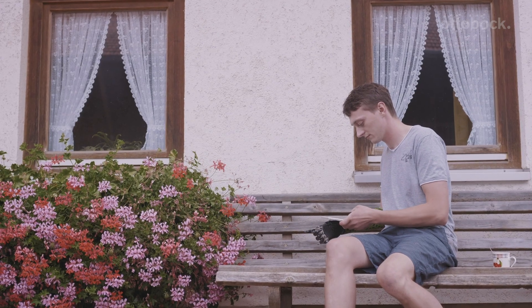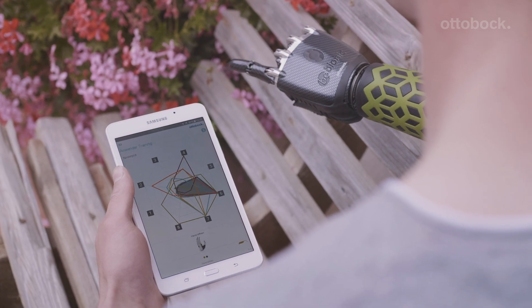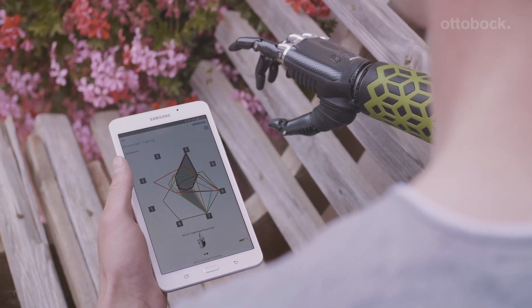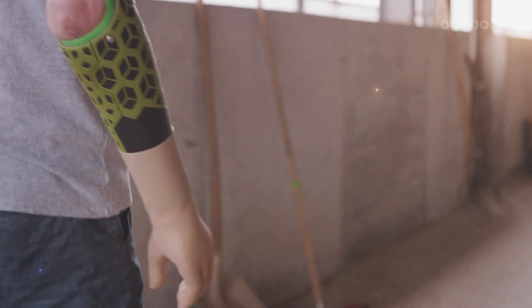The thing that I always found difficult with the other control system was that you had to switch. The big advantage of the Myo Plus app is that you can easily change a wide range of settings yourself. The fact that you're not thinking about how to grasp something anymore means that you essentially grasp it the same way you would with the sound hand. So I use it much more often.